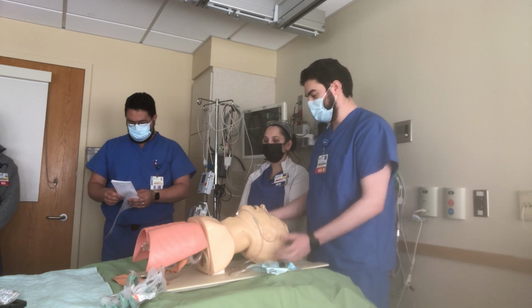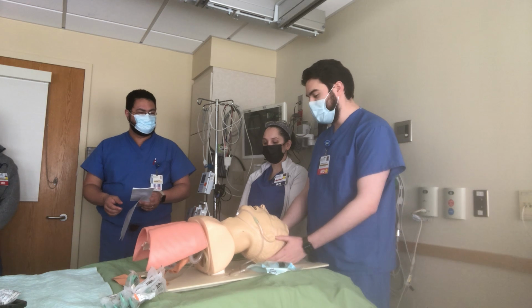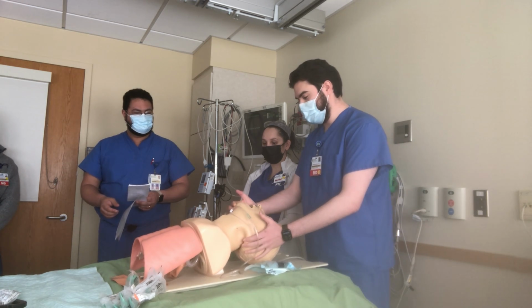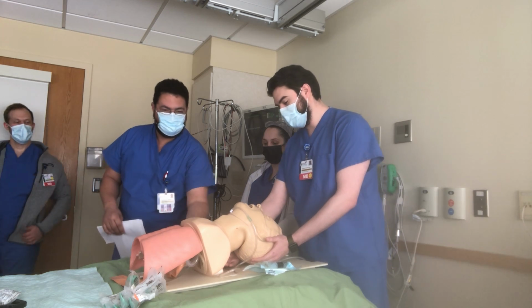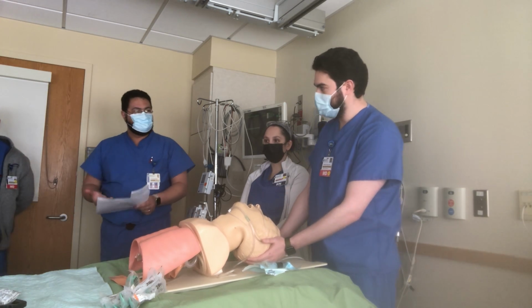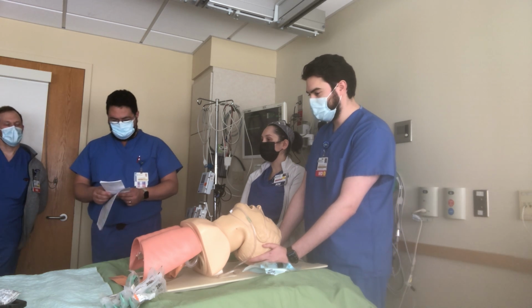You can have him in the sniffing position. Take off the pillow, put him flat, raise the head up and the chin up. Ideally you should put something under his shoulder, like a little folded towel, that gives him a little bit of a sniffing position that makes it easy for you.